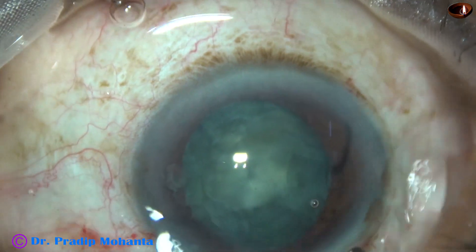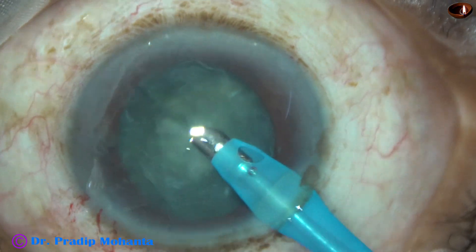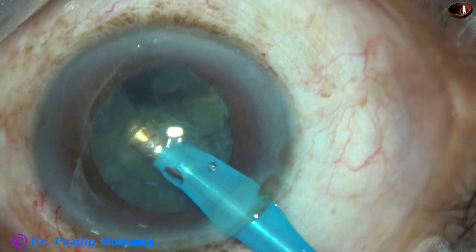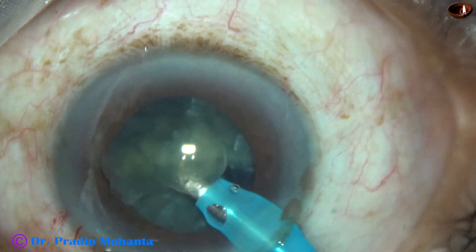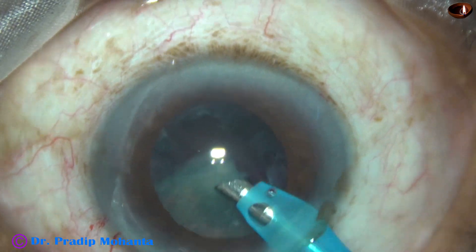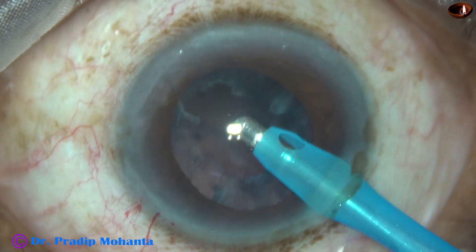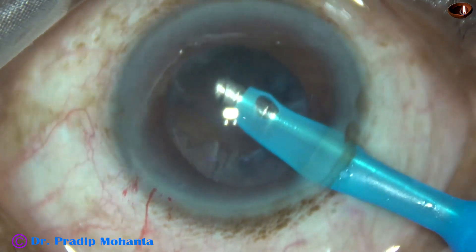If I use the chopper, the iris will tend to prolapse again, and there will be constant rubbing on the surface of the iris by the chopper, causing pigment dispersion and iris chafing. To avoid that, we just don't use the chopper — manage the nucleus single-handedly. Since the nucleus has been divided into four parts, see how easily the pieces come to the tip. Vacuum is 450 mmHg, flow rate is 45, ultrasonic energy is set at 60%, and the nucleus is managed so nicely, single-handedly, without using the chopper.